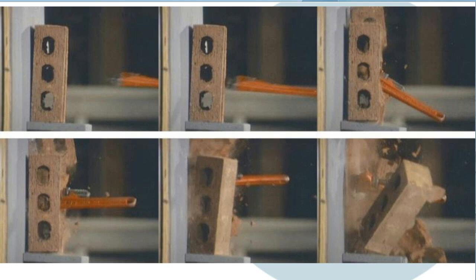This is one of the real risks associated with MRI. So how does that pertain to planners or designers? There's really not a lot we can do in terms of planning a facility that will keep somebody from walking in the room with a pipe wrench, is there?